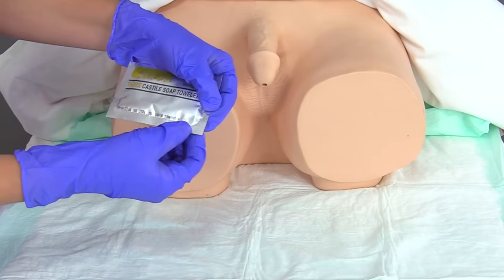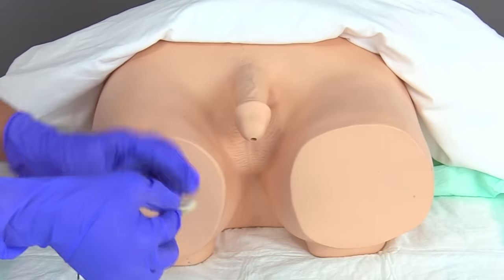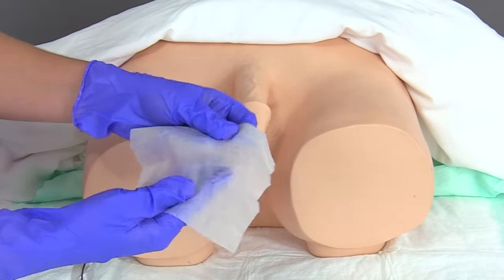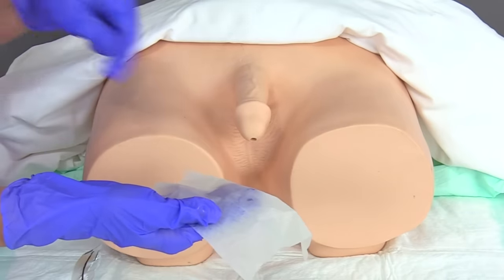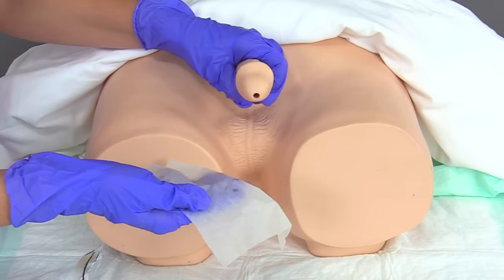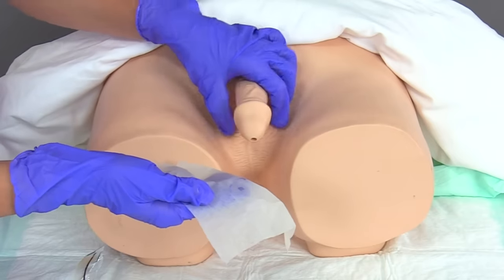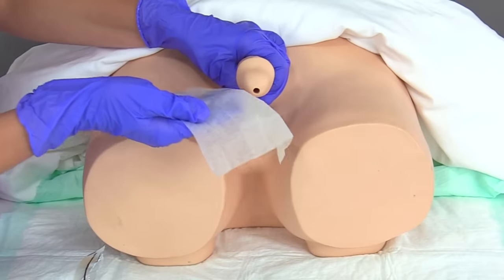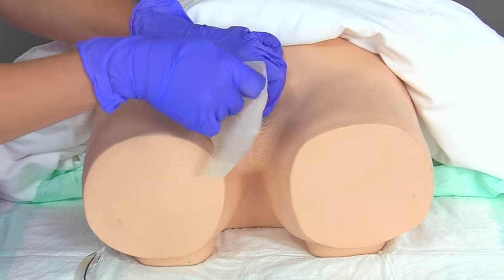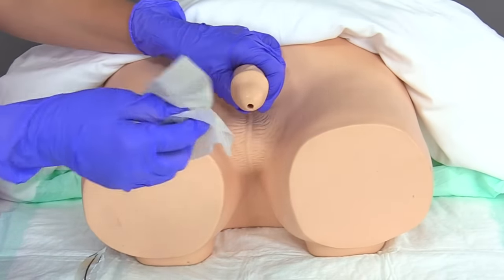Here are the castile wipes that assist us with peri care. I'm going to take the first wipe and clean the urinary meatus area first. I'll take my non-dominant hand to hold the penis at the shaft — if uncircumcised, I would retract the skin back. Starting at the urinary meatus, I'm going to clean in a circular motion, then discard this wipe.